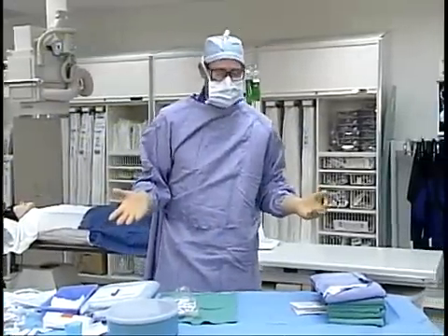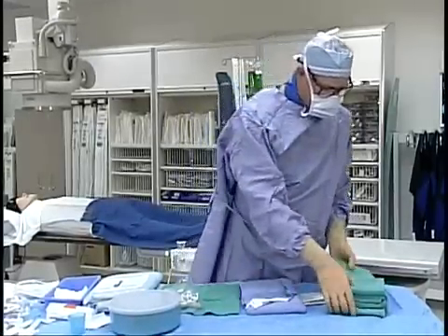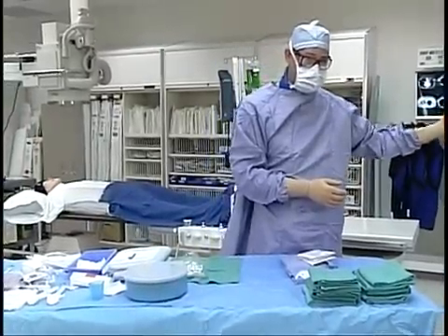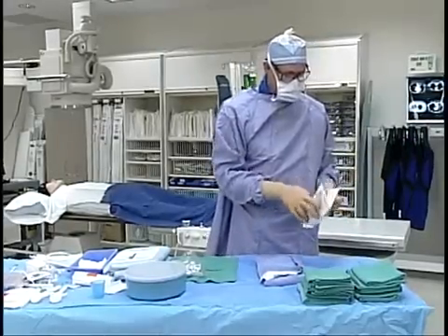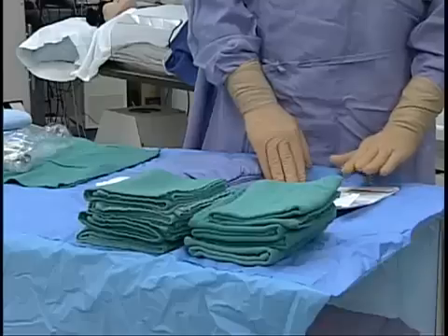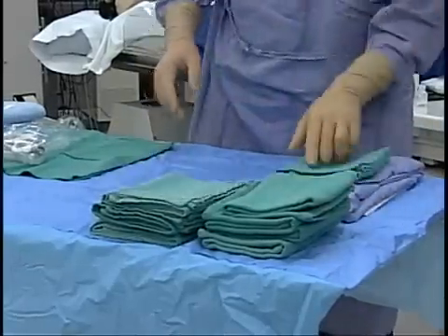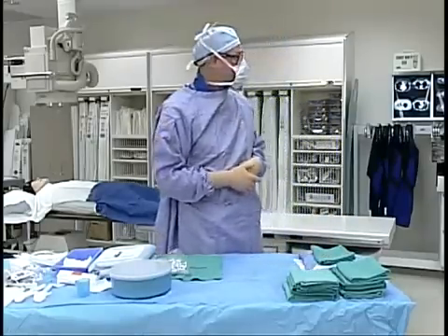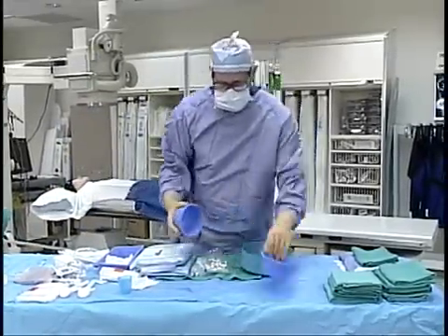We are now ready to arrange the table and the sterile products on the table in a manner that will be efficient for doing the procedure. The gloves and towels are placed on the side the doctor will come in when he scrubs. Things he's going to need are placed in reverse order: he will glove last, so his gloves go here with the label facing the right way up because he will be gowned differently. Then the gown and a towel, since he will dry his hands, then glove, and the assistant will help him put on his gloves.